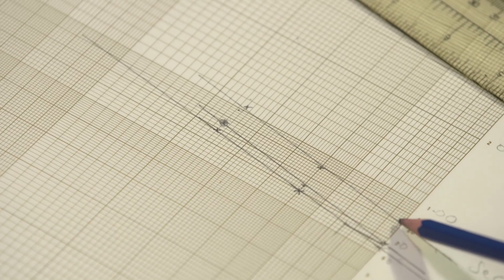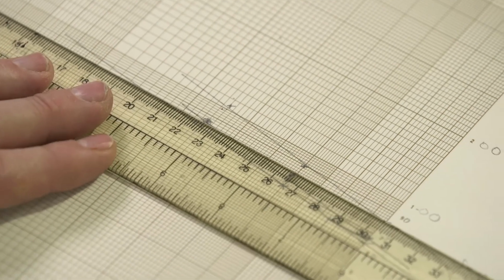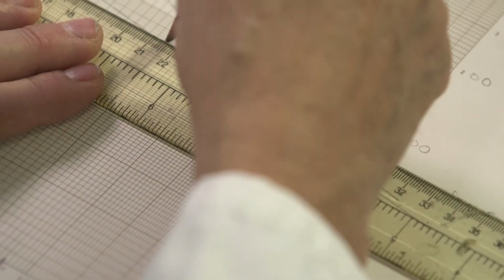Where does the line intersect the 100%? It does so at a clotting time around 82 seconds. Which is the concentration of standard? Where is 82 seconds?